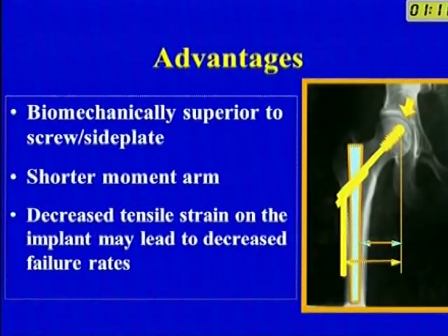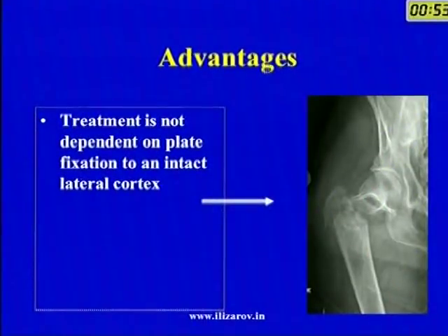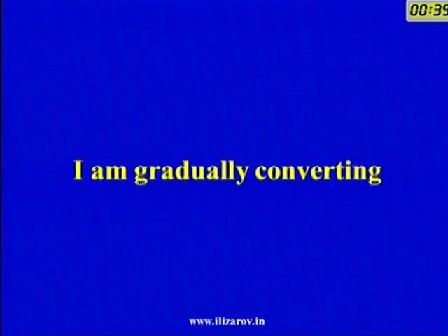Biomechanically, at least theoretically, it is superior to the side plate, because this is an intramedullary implant, so there is a shorter moment arm, and there is a lesser tensile strain on the implant, which could lead to lower rates of failure. You don't need to have an intact lateral wall to put this implant in. It does have a complication rate, but this is now coming down with better designs and more experience.